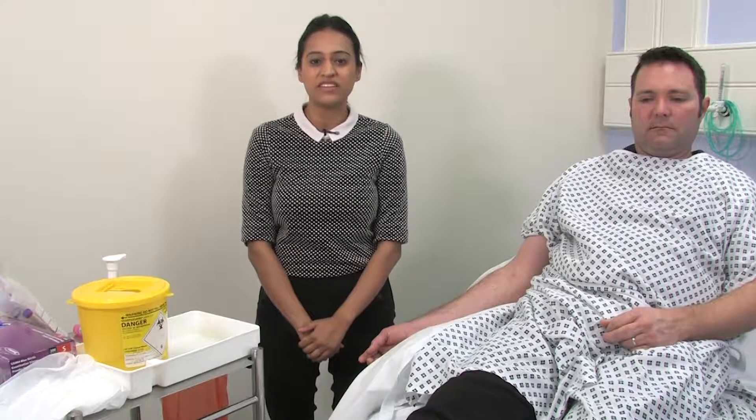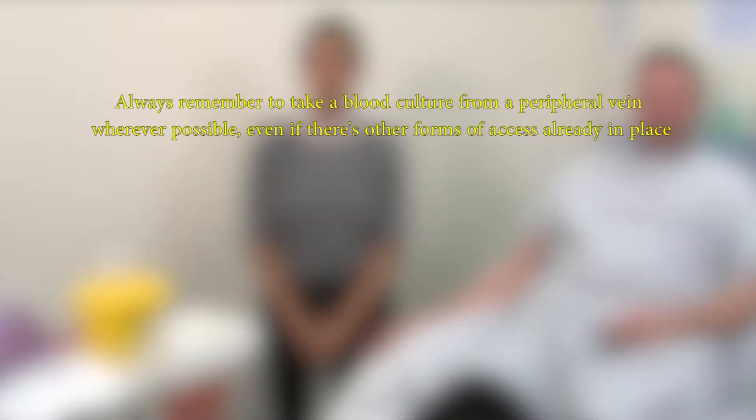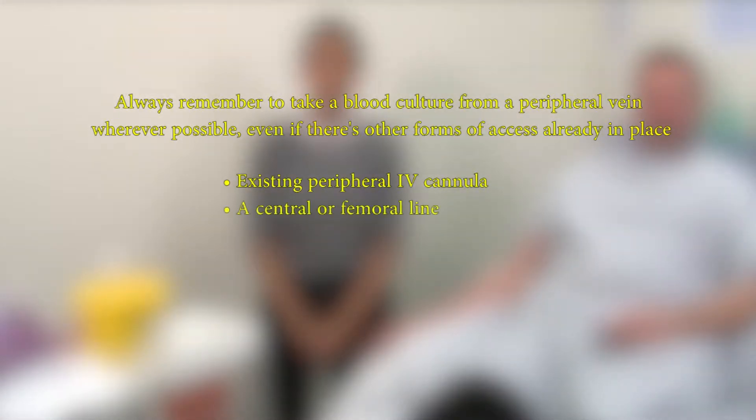Hi, my name is Dr Ravji and today I'll be demonstrating how to take blood cultures from a butterfly collection set. It's important to always remember to take blood cultures from a peripheral vein wherever possible, even if there are other forms of access already in place such as an existing peripheral cannula or a central or femoral line. It's important that the site is kept clean, healthy and is not broken, and that an aseptic non-touch technique is used.